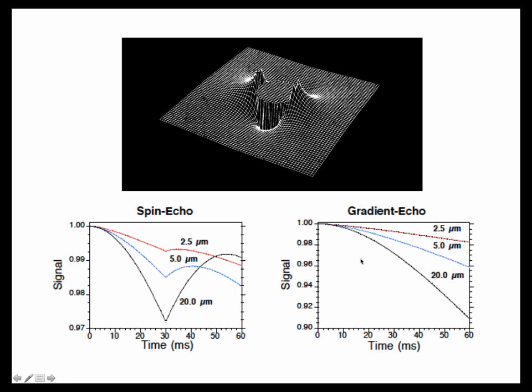Whereas with gradient echo, the bigger the compartment, the less you have diffusion blurring things out, and the better off you are. Whereas with spin echo, the more it's attenuated, the more sensitive you are to BOLD contrast. So the less attenuated, the less sensitive you are. With spin echo, if you have a massive compartment, it will completely refocus almost everything, even if it is diffusing, so you won't see anything. With a compartment that's too small, you also won't see anything.